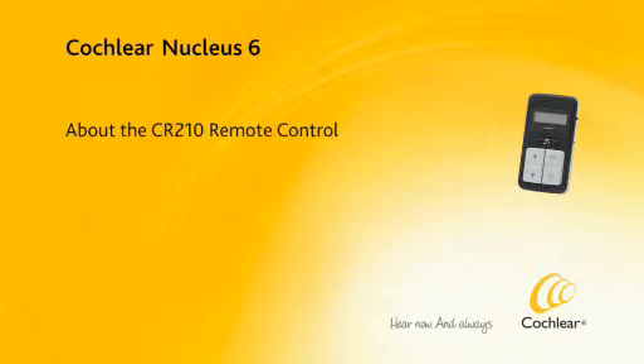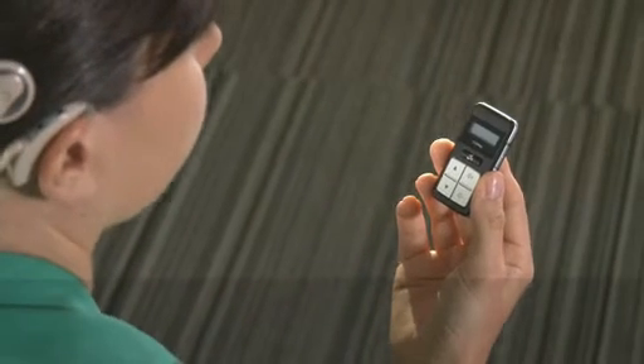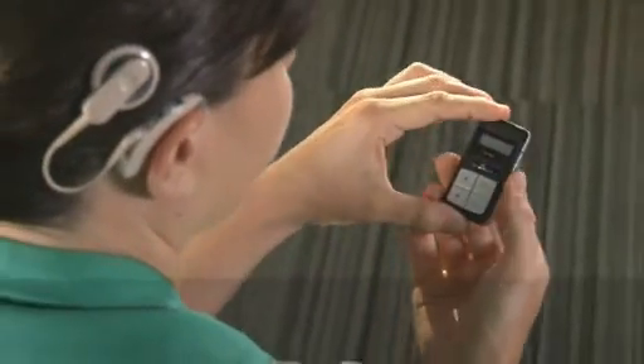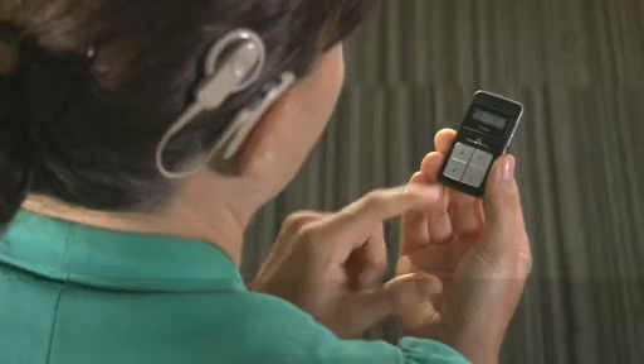About the CR210 Remote Control. The Cochlear Nucleus CR210 Remote Control is a handheld device for controlling the commonly used functions of your Cochlear Nucleus CP910 or CP920 sound processor.